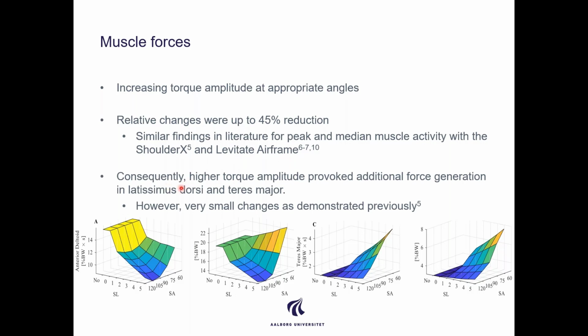So the consequence, of course, as I was talking about, was that when we provide more torque than we need for the motion, we are increasing some of the extensor muscle activity. And in some cases, we're also increasing some of the flexor muscle activity or muscle force, sorry.